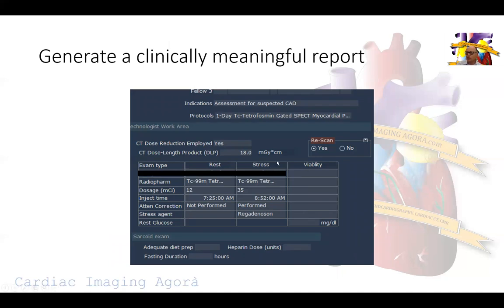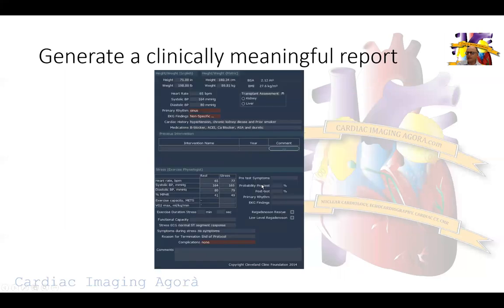Now we generate the report. As part of quality assurance measures to track what we're doing in our lab, this will be coded as a re-scan because we had to re-scan the patient. We don't need to do another dose - all we have to do is re-scan. The injection was 12 millicuries at rest and 35 millicuries post-stress, and we re-scanned them.